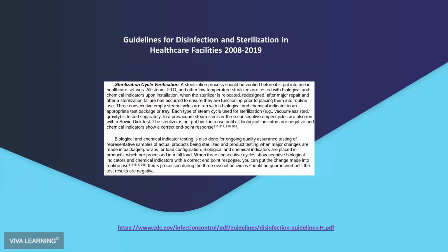And also, if you are using a pre-vacuum sterilizer, at the beginning of each day, you have an additional monitor that you need to do, which is called a Bowie-Dick or an air removal test, to make sure that that vacuum, which is part of helping the steam to penetrate into the packages, is actually working. So Bowie-Dick tests must be done on pre-vacuum sterilizers at the beginning of every day. And again, that information is in those guidelines from the CDC.